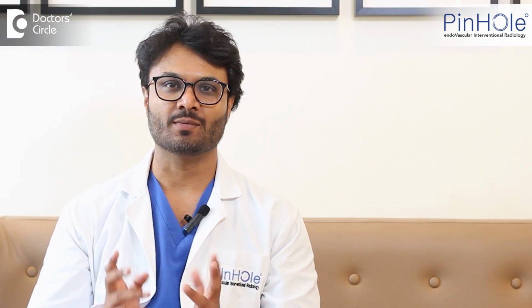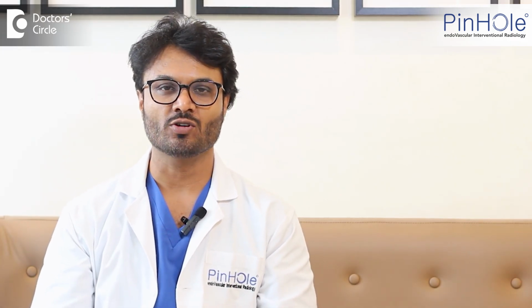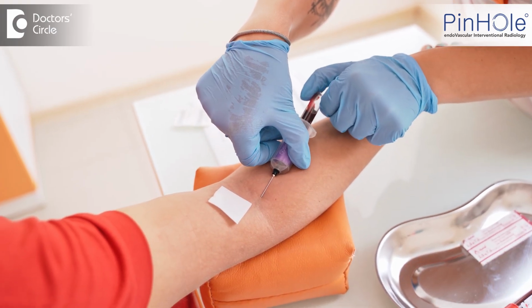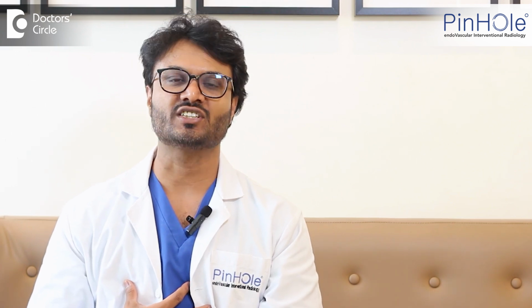Ultrasound or CT guided biopsy is a very simple procedure wherein, like how you draw your blood, you show your hand and they find out the vein, put a needle into the vein, draw the blood. In this ultrasound or CT guided procedure, deeper structures in our body which cannot be visualized are visualized on the scan.